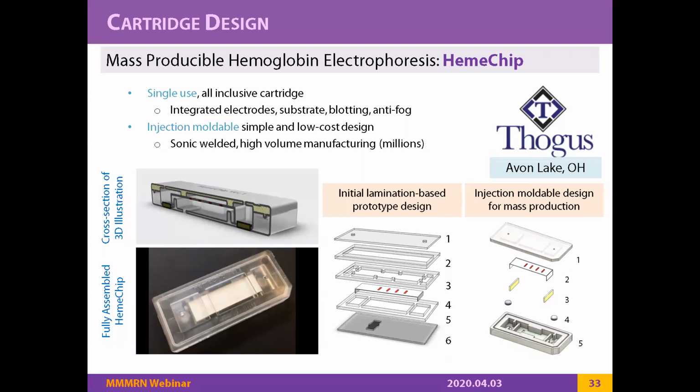I got to work with a lot of other companies, not just the companies I mentioned here. I worked with a company called Andrews Cooper, who developed the reader for us. Focus Product came up with this design that you're looking at here. From this one, we worked with expert engineers, because the design had to be transferred in some way so that it can be injection molded. And then we worked with a lot of contractors who were really expert on the software side, image analysis side.